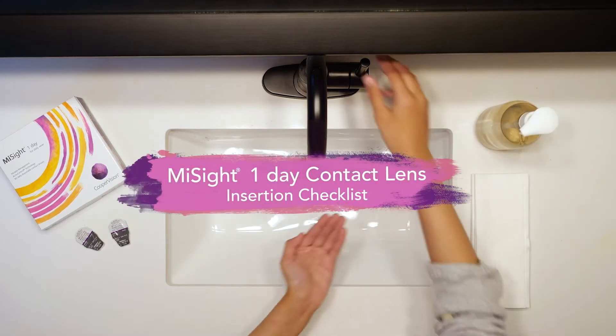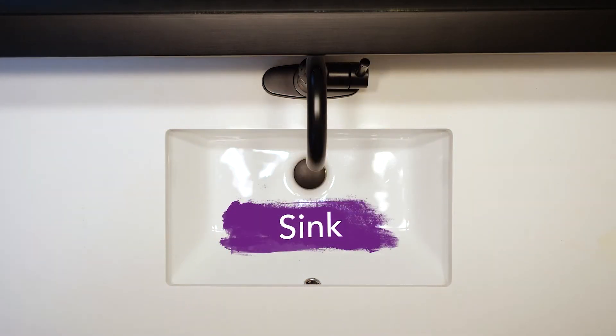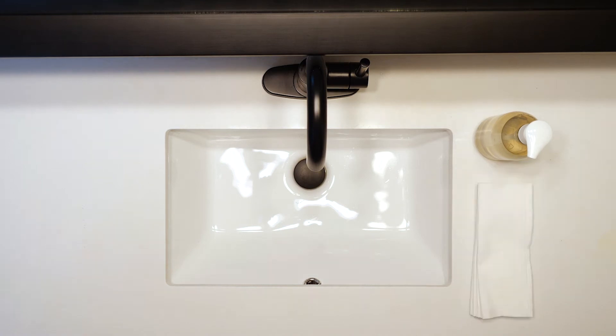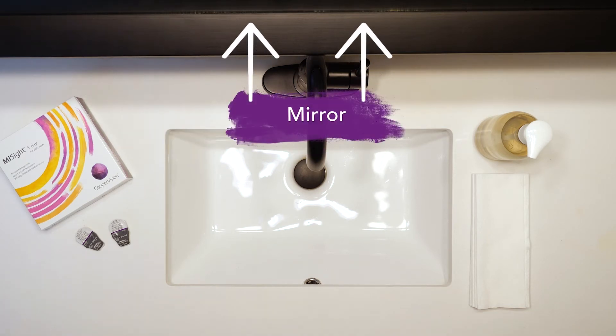Here's a checklist of what you need for inserting and removing your MiSight 1 day contact lenses. Start with a sink to set everything up, non-scented hand soap to wash your hands with, a non-fluffy towel to dry your hands, MiSight One Day contact lenses for your eyes, and a mirror so you can see what you're doing.